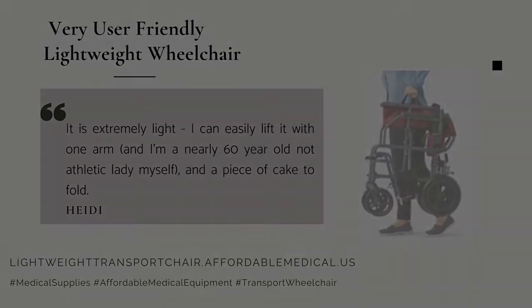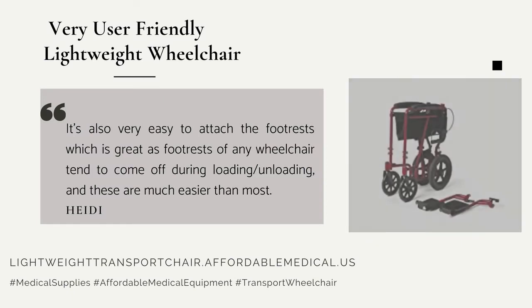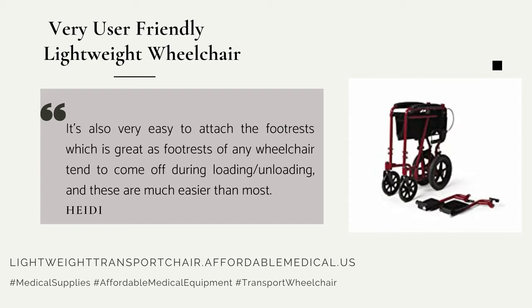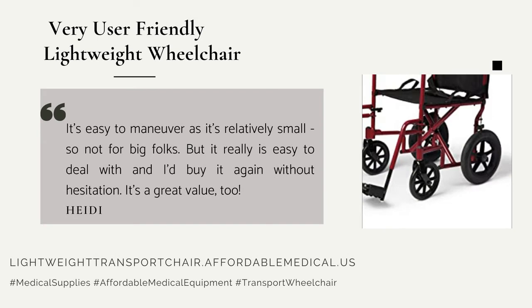It's also very easy to attach the footrests, which is great, as footrests on any wheelchair tend to come off during loading and unloading, and these are much easier than most. It's easy to maneuver as it's relatively small — so not for big folks — but it really is easy to deal with.